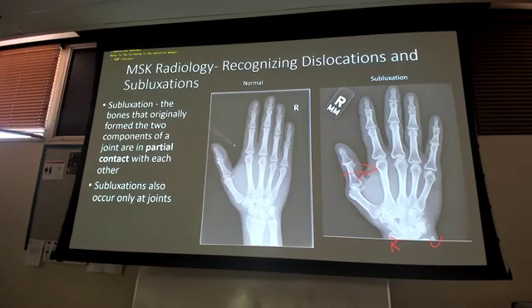So would you do the same thing if it was a dislocation, you still call it the first proximal phalanx? I probably would in the hand because there's just so many different bones and areas. You say MCP to me, I'm like, yeah, it could be that. And this sounds silly, but how do you know the person you're talking to didn't confuse the MCP with the CMC, right? All these abbreviations. When dealing with the hands and the wrist and that area, there's so many different bones and joints. I find it more descriptive just to say this is the bone that's moved, this is the direction it's moved, it's not supposed to be there. As opposed to dealing with the joints, whereas knee, shoulder, pretty clear and self-explanatory in that aspect.